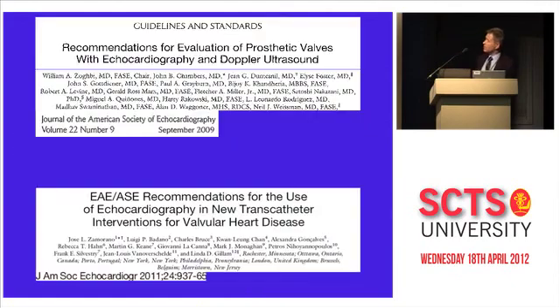Now, I can point out that there are two very important publications that I've used in the preparation for this. There is not a lot around. If you search the literature, there are almost no publications on intraoperative assessment of paravalvular leaks. All the publications are on endocarditis, cardiology publications, and the breakdown of the suture lines. So we don't really have any information on paravalvular leaks discovered intraoperatively. But these are two good papers one can use as guidelines and some good recommendations on what we should do.